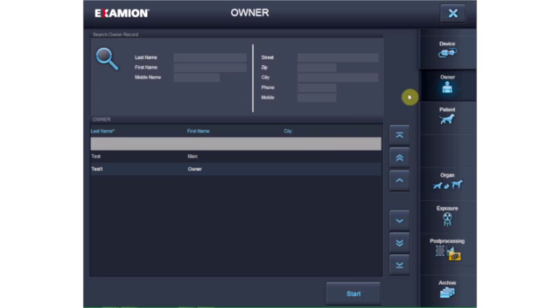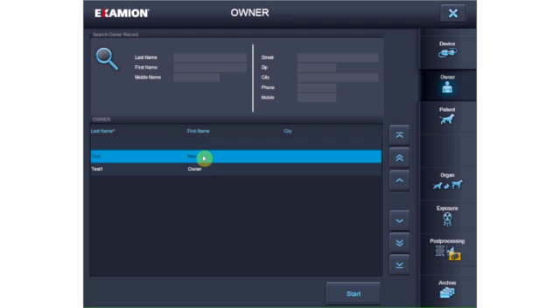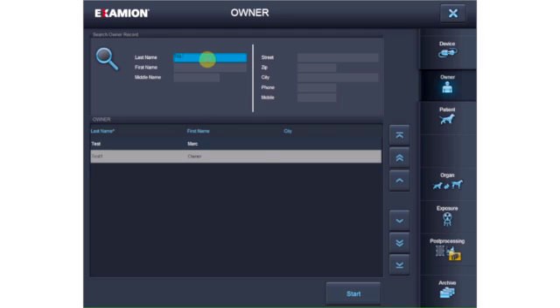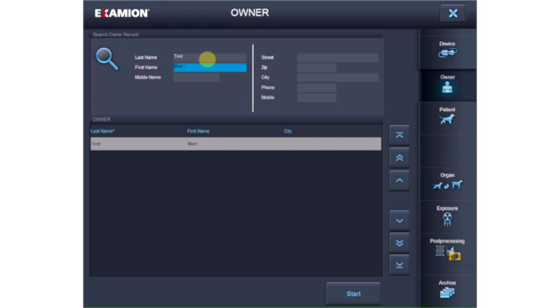You can select the animal owner either directly from the local database or from a DICOM worklist. Of course, you can also enter the data manually to be ready to act immediately in emergency situations. Other interfaces, for example BDT and GDT, can also be integrated.